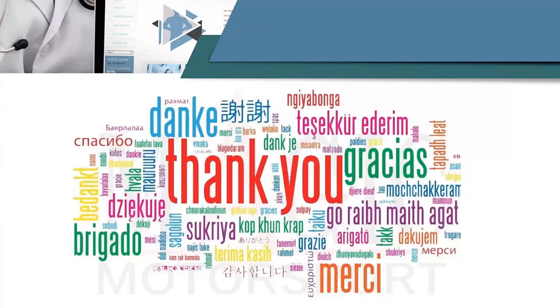See what happens if you don't have an in-house radiologist also. For a CR or DR image, after the processing is done, the image automatically goes into the PAC system. So the radiologist, wherever he's sitting, within the hospital premises or outside, can view the image on the PAC system and report online.